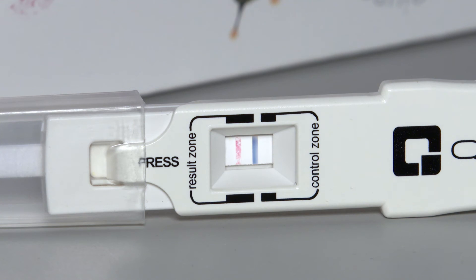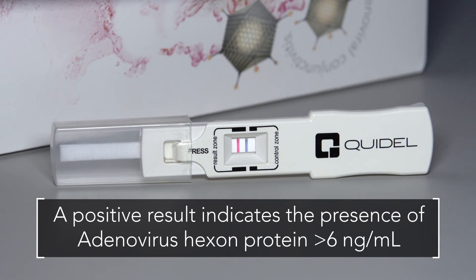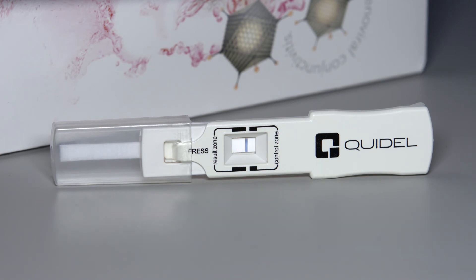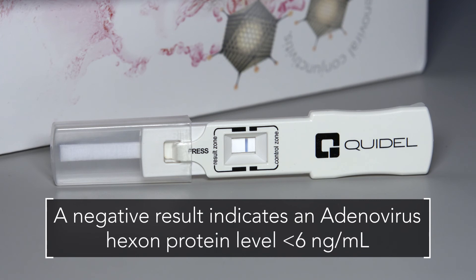An uneven or incomplete red line is due to an uneven distribution of tear fluid on the sampling fleece. Even if the red line is faint in color, incomplete over the width of the test strip, or uneven in color, it must be interpreted as positive. A positive result indicates the presence of adenovirus greater than 6 nanograms per milliliter. The presence of only a blue line in the control zone indicates a negative result, indicative of adenovirus less than 6 nanograms per milliliter.